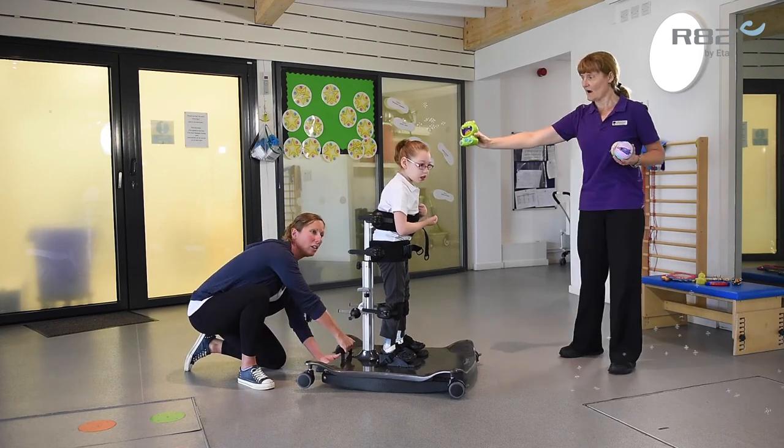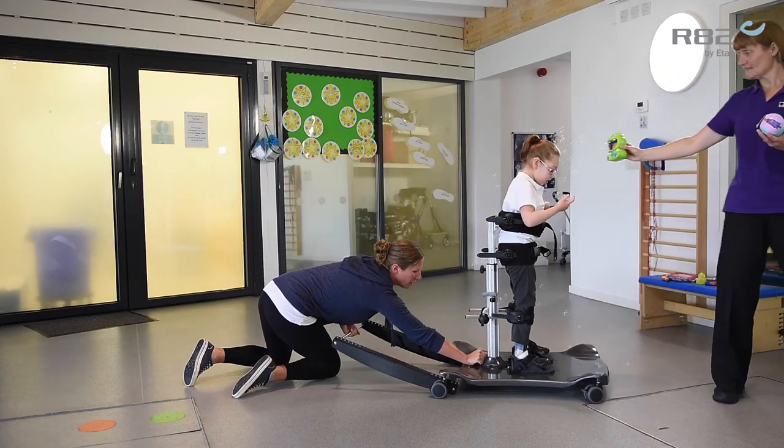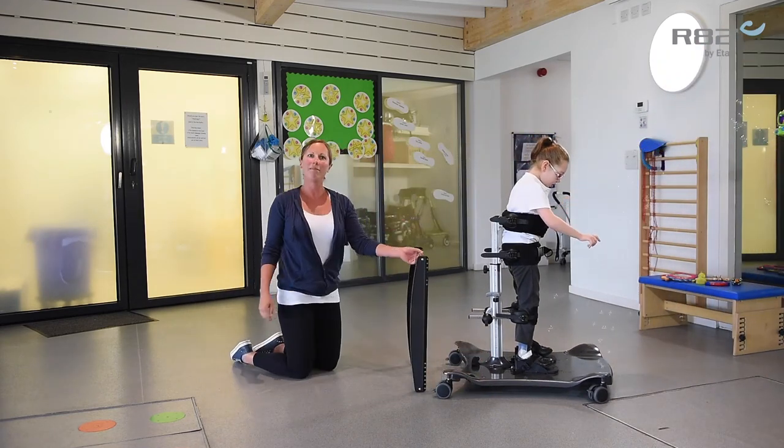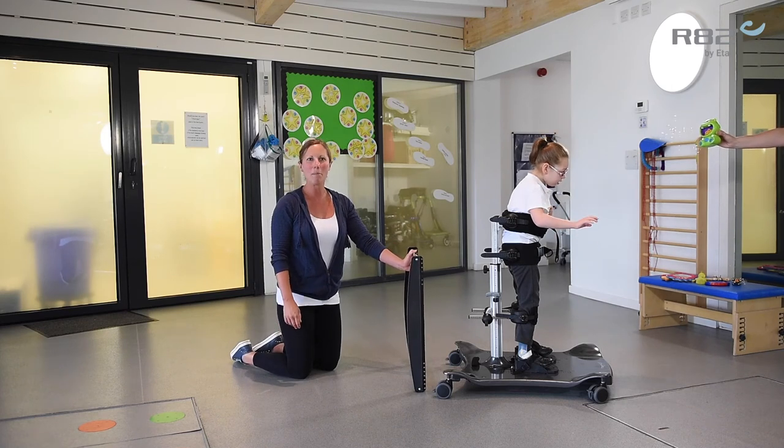We're going to lift the handle — ready Poppy — coming out. Reaching the slide, pop it forward. Nice, simple and easy and the rocker's out. And now it's back to the static, simple slide.